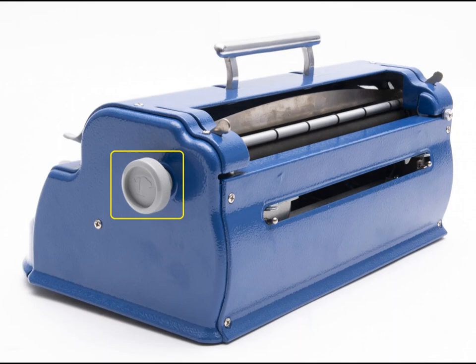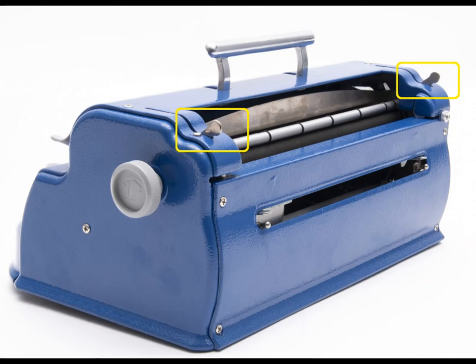The paper release levers are two levers that are at each end of the Brailler on the top surface, near the back. If you move one lever forward or backwards, the other moves as well. They are used to secure the paper in place before rolling it into the Brailler, and they must be lifted up in order to insert the paper.